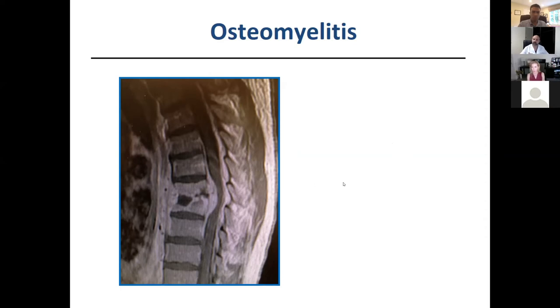Got it. Although both are options. Yeah, but Wendy, again, sorry to put you on the spot. I know I usually don't show a lot of these images, but we had a session in which we were talking about the difference between an epidural abscess and a phlegmon. So with this T1 with contrast, would you say that this is phlegmon or abscess, or can you tell?